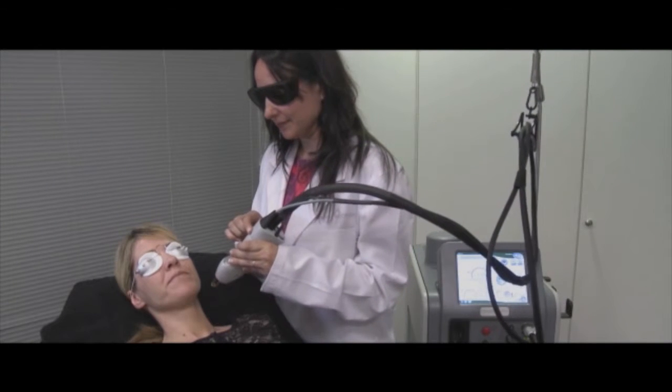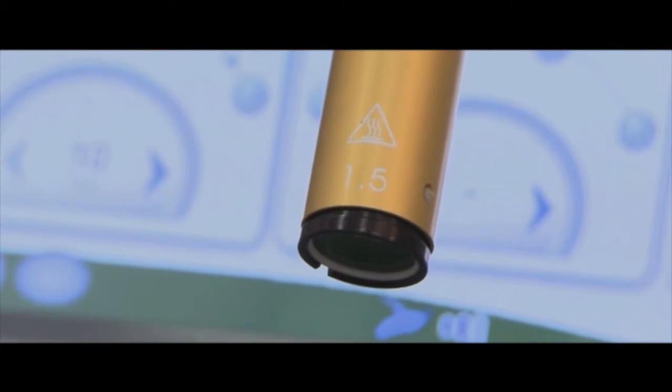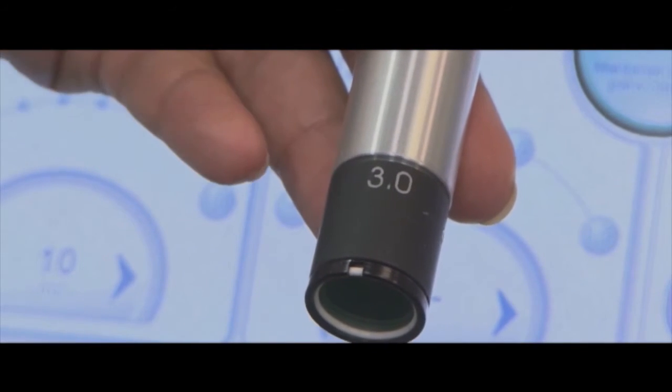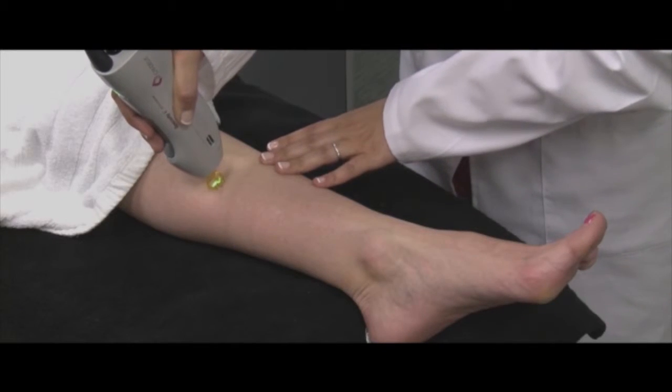Vascular treatments are done using 3 different spot sizes: 1.5 millimeters for facial and leg vessels, 3 millimeters for leg vessels, and the 3 by 10 millimeter elliptical spot for leg vessels.